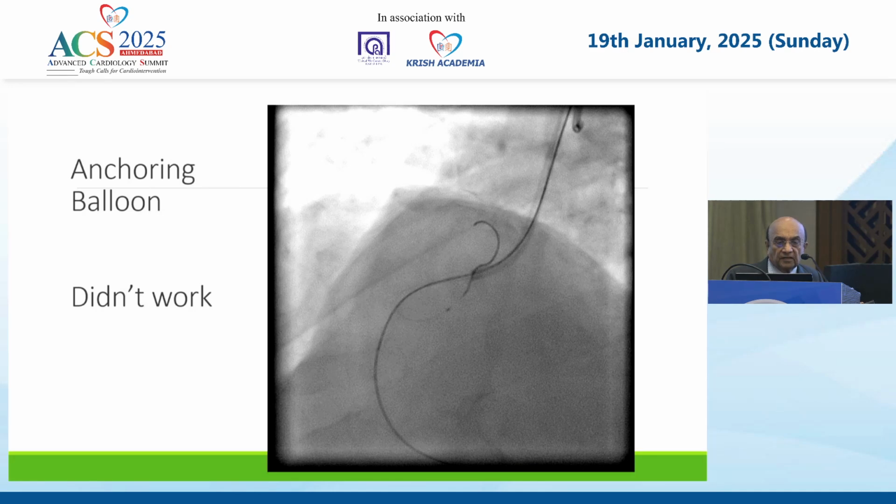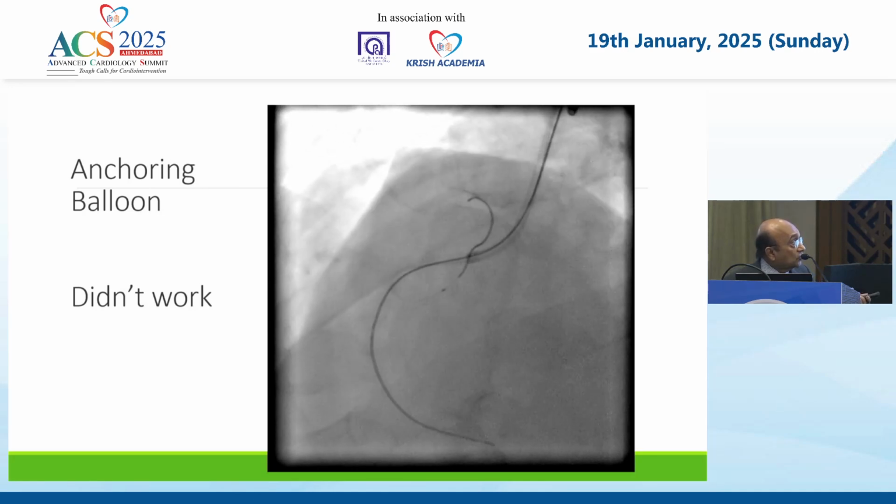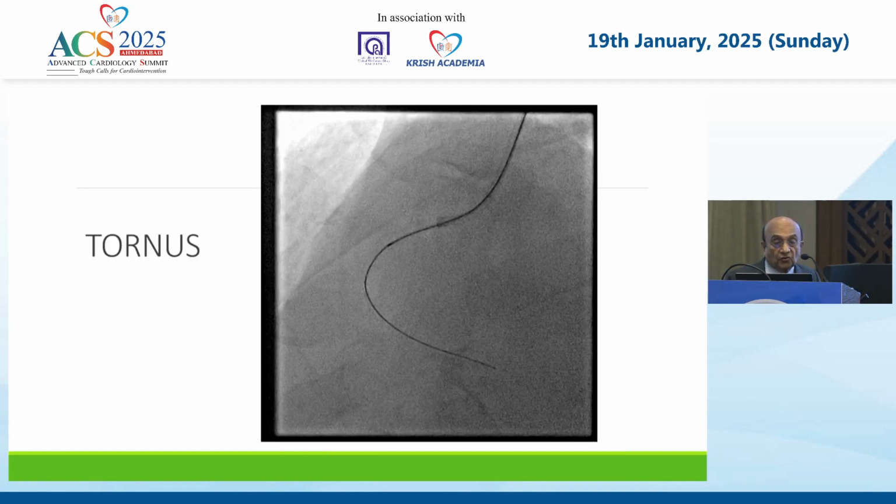The anchoring balloon technique did not work. Nothing would cross still. So then what to do now? I decided to take Tornus.